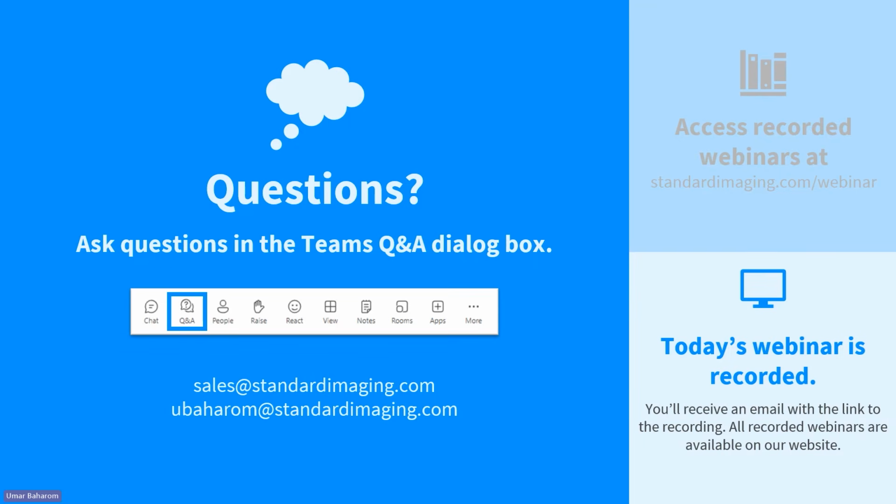So yeah, that's pretty quick on the MRgRT Phantom. It's much simpler than the one for diagnostic. It's really just for your large field MR distortion.